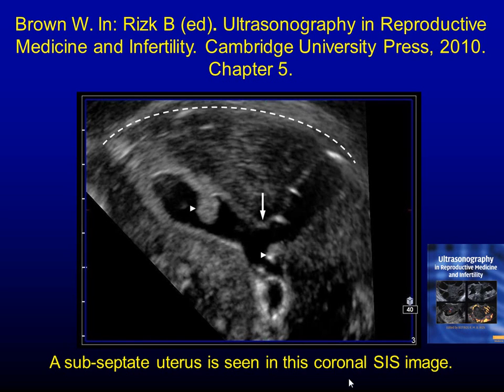If your time allows today, I would love to show it to you. She has a big septum, not a septum like that. She has a big septum like that. It is not so deep, but it is so wide. So it left her with a small pocket here in which implantation.